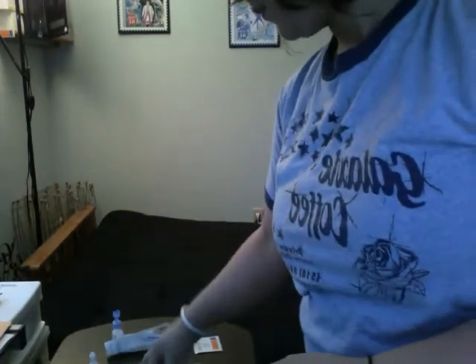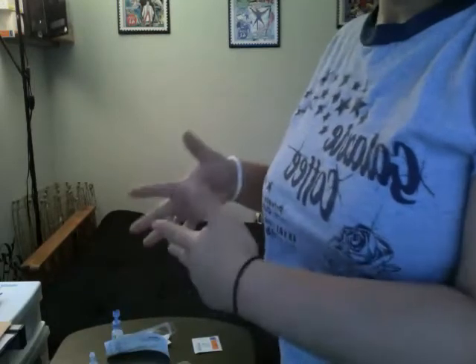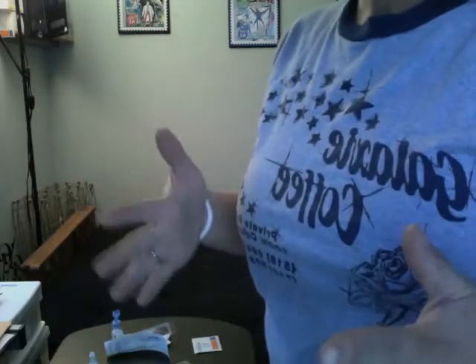Now what I need to do is insert my infusion set. I don't use any of those devices. I know some people do. I like being able to control if it hurts or doesn't hurt, so I do it all. I washed my hands before I started prepping my area. So my hands are already clean, which you want to make sure of, that your hands are always clean. And use antibacterial soap. And my site today is going to be in my stomach. This is my previous site.